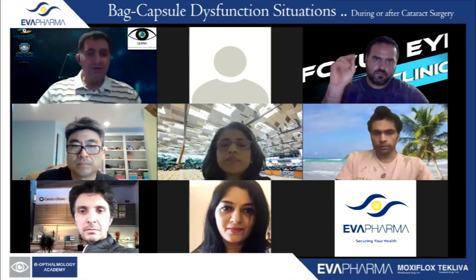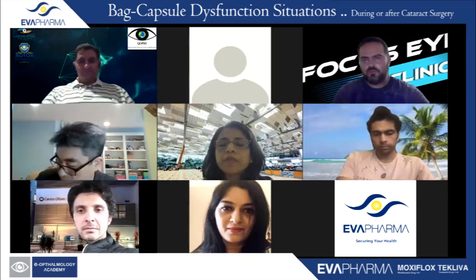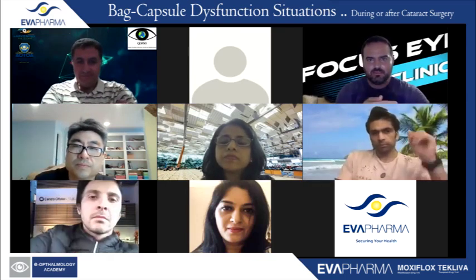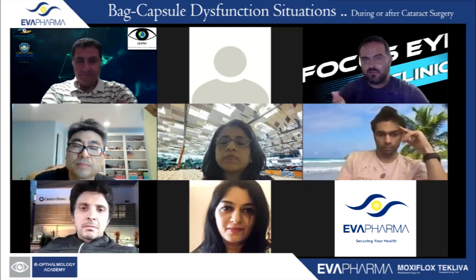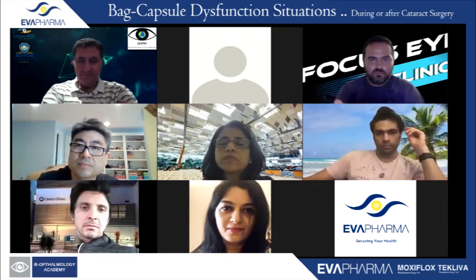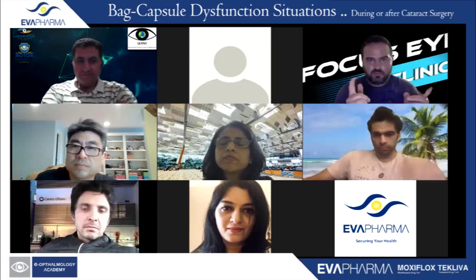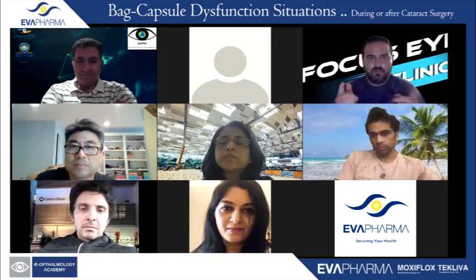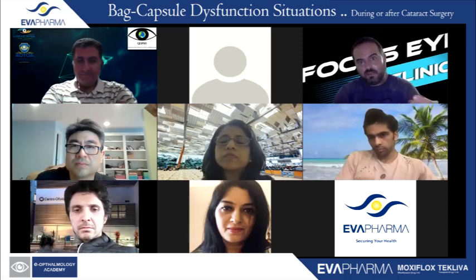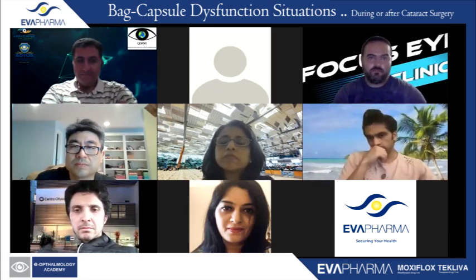Lukan, go ahead. I have a question. I noticed that you make the sclerotomies from inside out, and the aim is again 1 millimeter from the limbus. First, do you do them at 9 or 3 o'clock? How do you avoid the larger ciliary body vessels? And do you have any issues with bleeding?